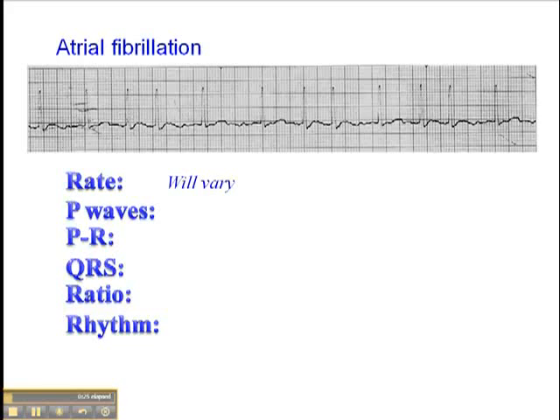the heart rate is fast because the cause of atrial fibrillation is multiple ectopic foci in the atria, and they bombard the AV node, and a number of those impulses get through to the ventricles, and consequently, with new onset, heart rates are fast, and sometimes they're very fast and need to be treated on an urgent basis.